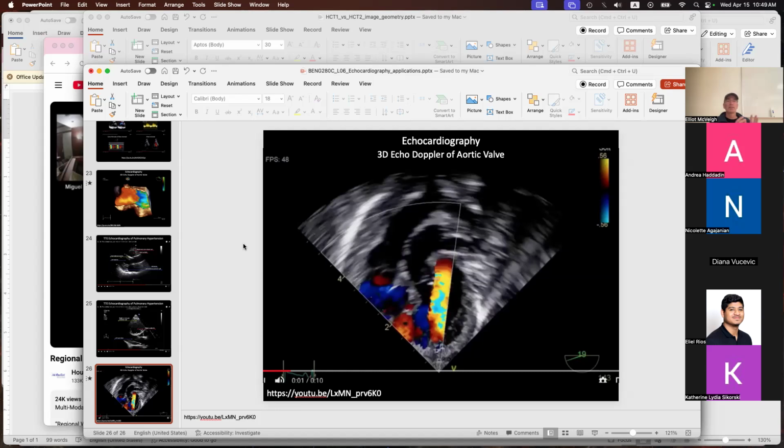The machines themselves can be super small. There are machines, I kid you not, that look like this. You do this, the thing's here, and you watch on your phone, right? That's pretty cool, right? So that's the cheap end, and the expensive end is about $400,000 to $500,000 with all of the signaling bells and whistles inside, right?